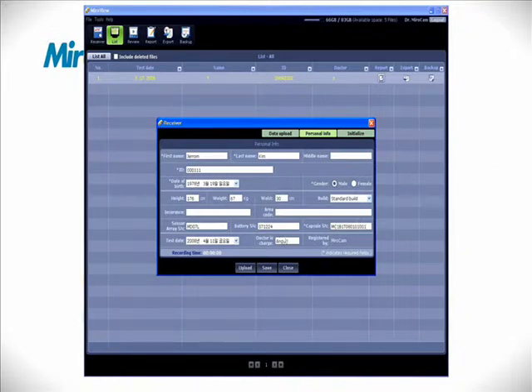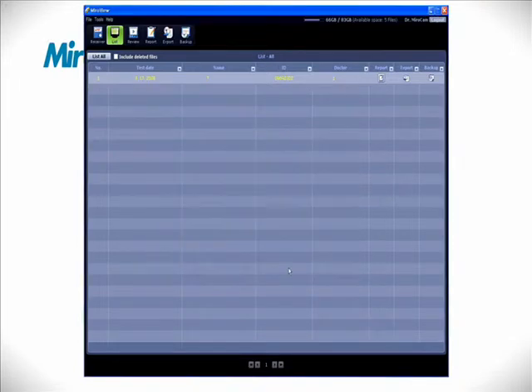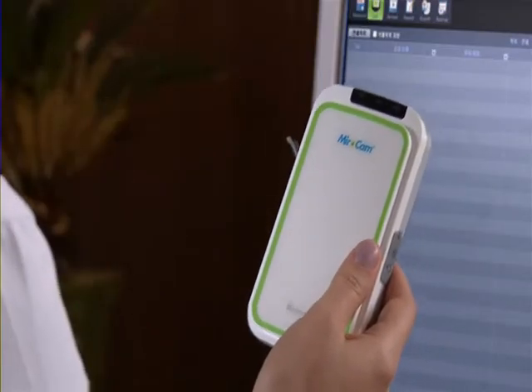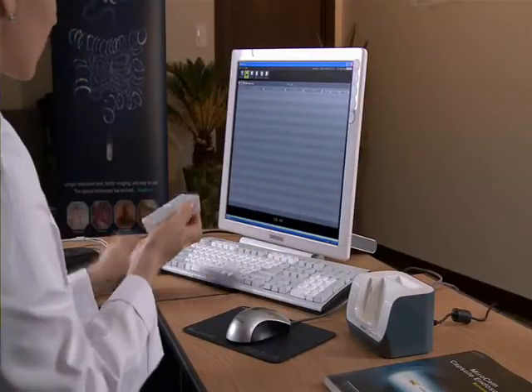After entering the patient data, click the Save button. Disconnect the USB cable from the receiver and attach the fully charged battery to the receiver.